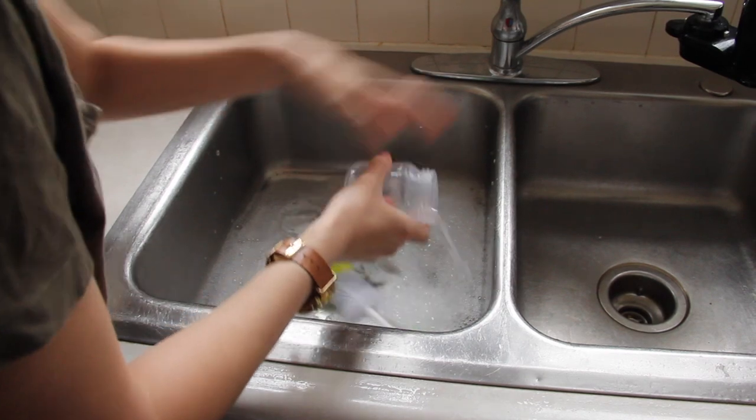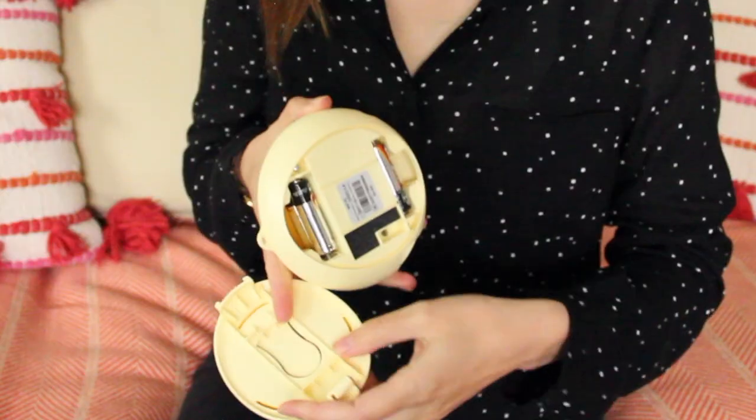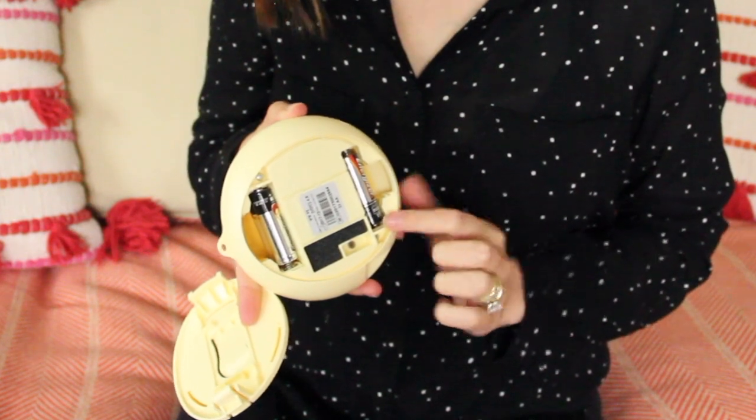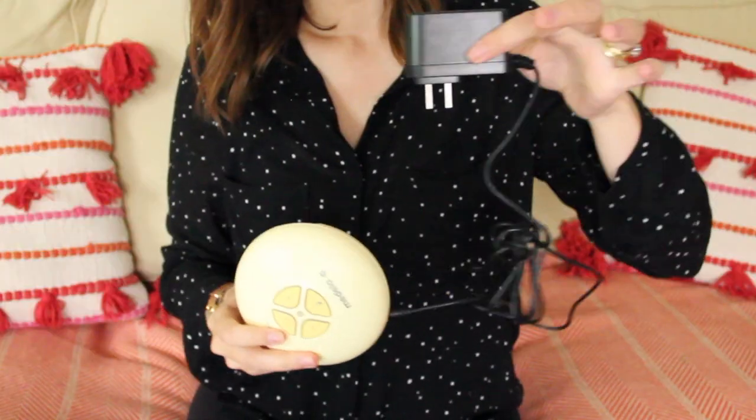When you first open the Medela Swing, you're going to want to wash and sanitize all the parts before your first use and every time after using it. You have two different powering options: either the battery pack which takes four AA batteries, or the wall outlet with the AC adapter.